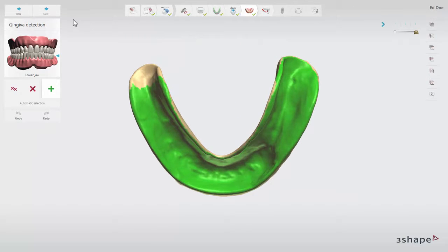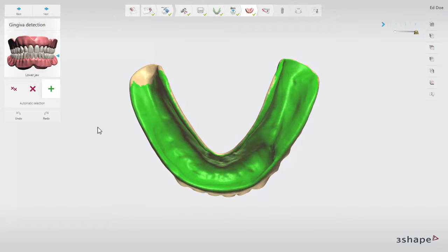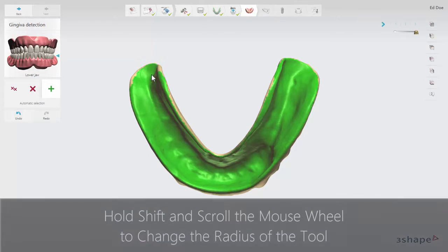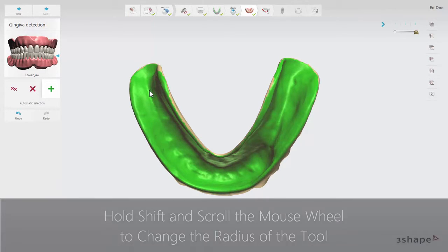At the gingiva detection step, the gingiva surface of the denture is detected automatically. However, it can be adjusted manually. Click the Add button to mark the gingival area on the denture — it will become green. Change the radius of the marking tool by holding Shift and scrolling the mouse wheel up to enlarge or down to decrease.